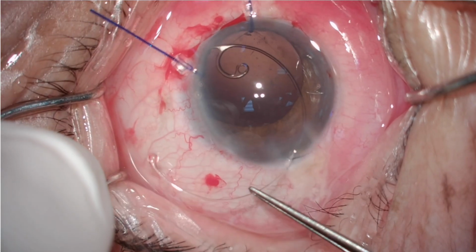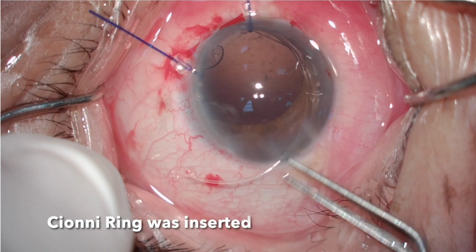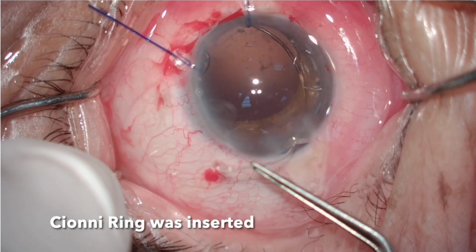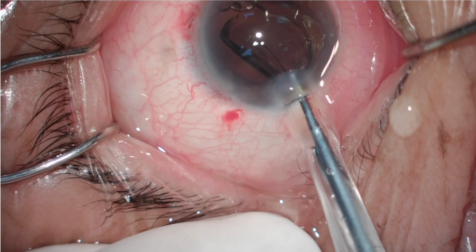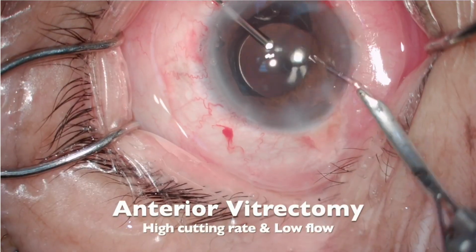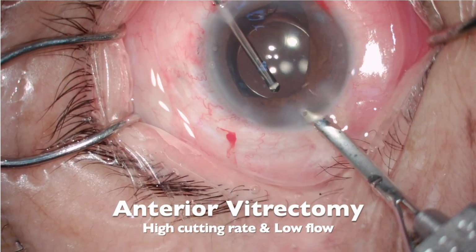I use only the capsular tension ring without scleral fixation for this patient. If the zonules lose integrity in the future, it's easy to suture to the sclera through the Cionni ring. The IOL haptic was placed to the site of dialysis. I insist on using a monofocal IOL to minimize the impact of IOL tilting and decentration. However, zonular dialysis was worse than it looks.